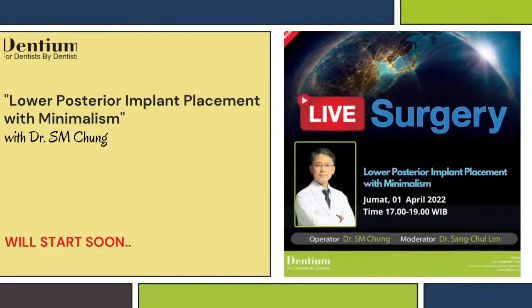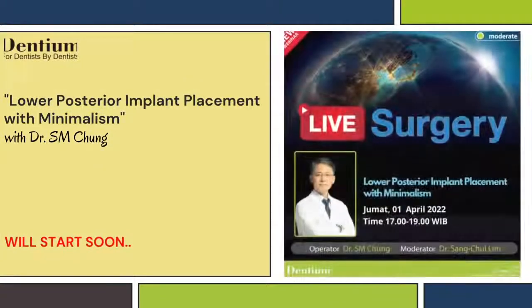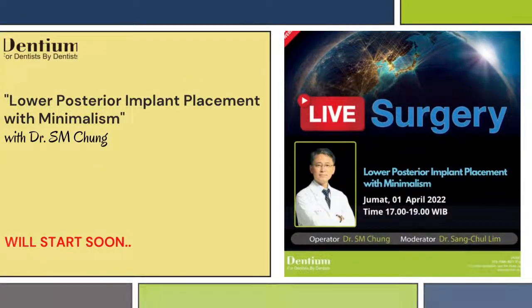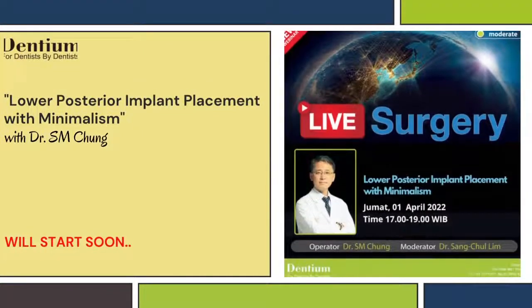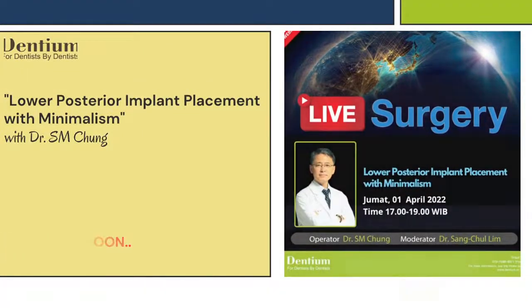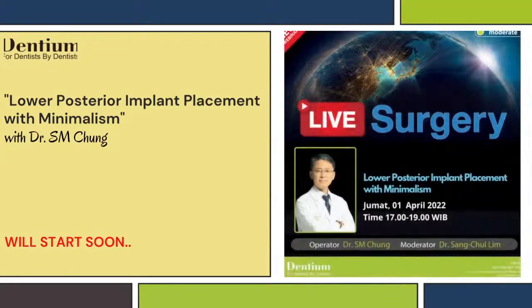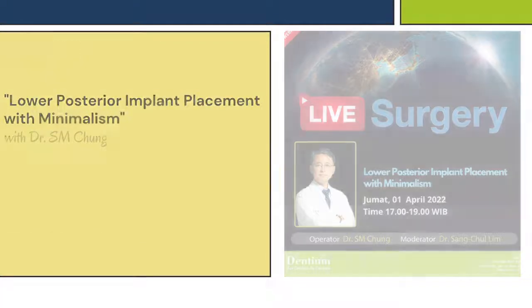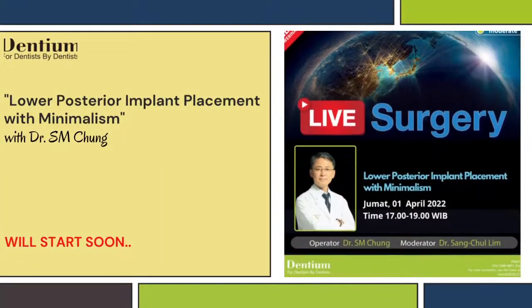About this Bright tissue level implant, actually this implant design is very unique, as you know. It has an external 20-degree connection type, a built-in screw abutment type, a unique design especially of the top portion connection.